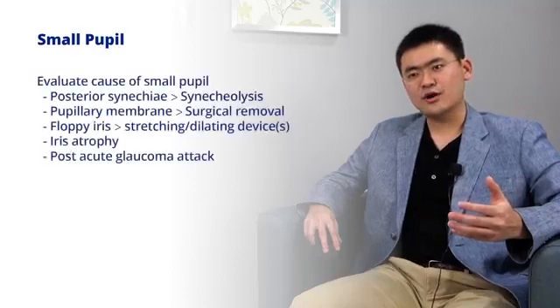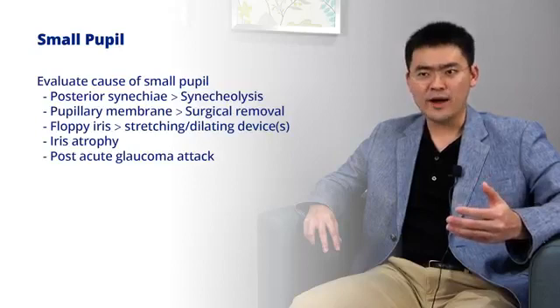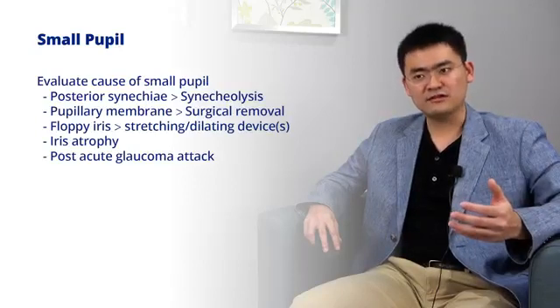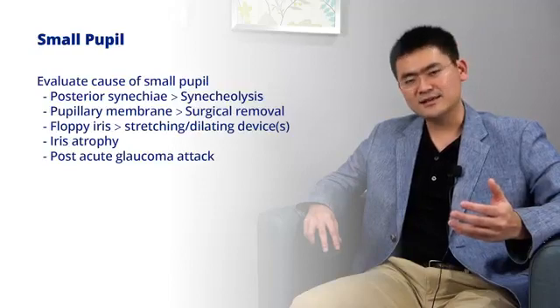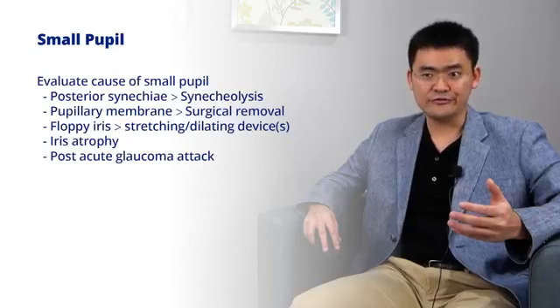To manage the small pupil, first, the surgeon might need to evaluate the cause of the small pupil and correct it in the right way. For posterior synechiae, we can do synechiolysis with various techniques that I'm going to show you today. Pupillary membrane can be removed.